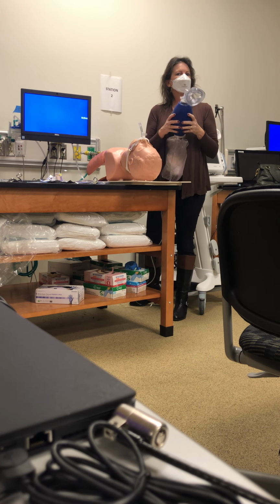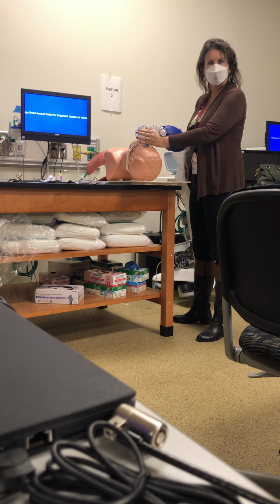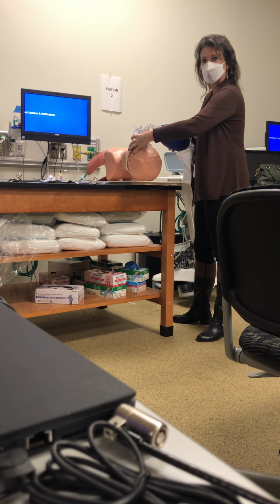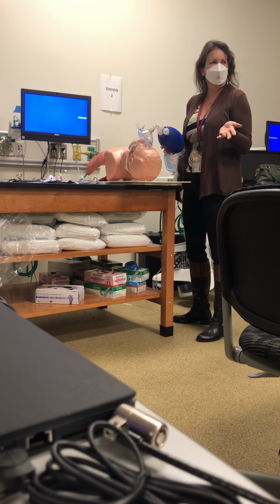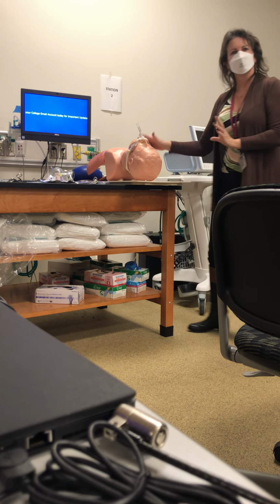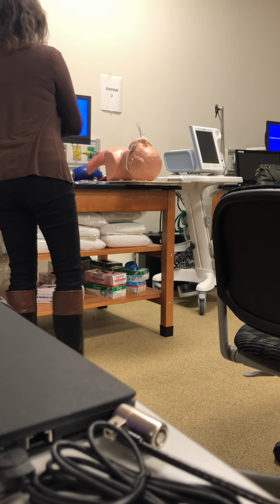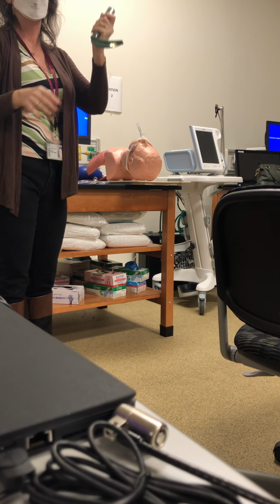Okay? So now we're bagging our patient. He's intubated, but we're bagging our patient, right? Nose to chin. We're doing the C to E, right? Position. We're getting their SATs up to about 100%. We're hyper-oxygenating this patient, okay? So then the therapist is gonna continue doing that, or a nurse. Then we're gonna get our blade ready, our handle on our blade, and what is this one?